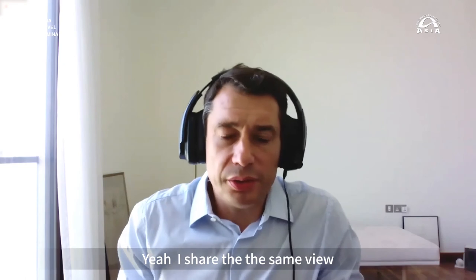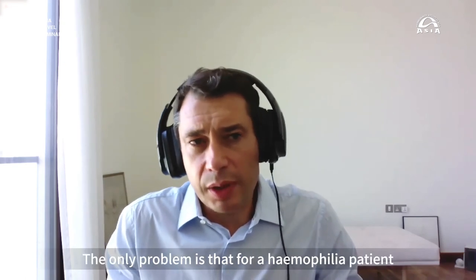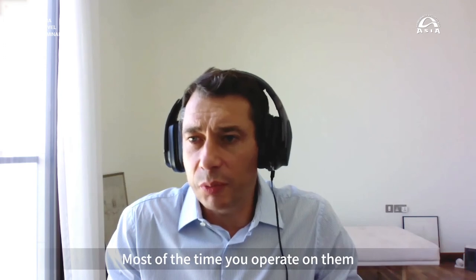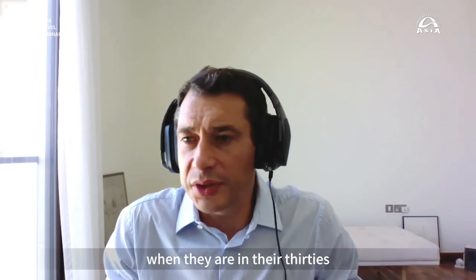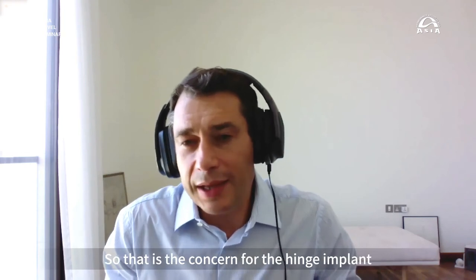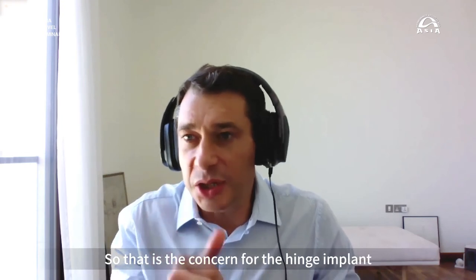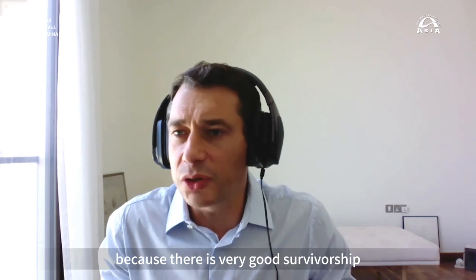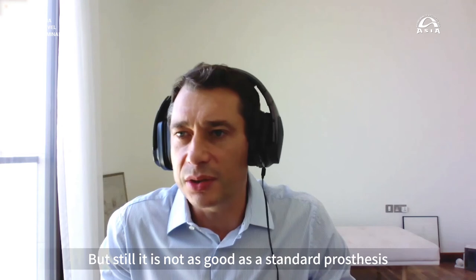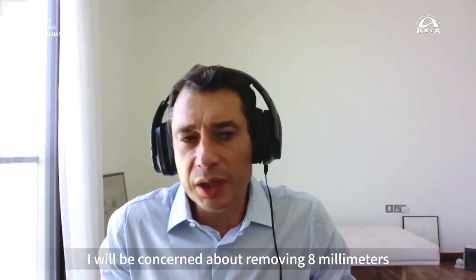Yeah, I share the same view. The only problem is that hemophilic patients are very young. Most of the time you operate on them when they are in their 30s, sometimes even younger. So that's the concern with hinge implants, because there's very good survivorship with the rotating hinge implant nowadays, but still it's not as good as a standard prosthesis.